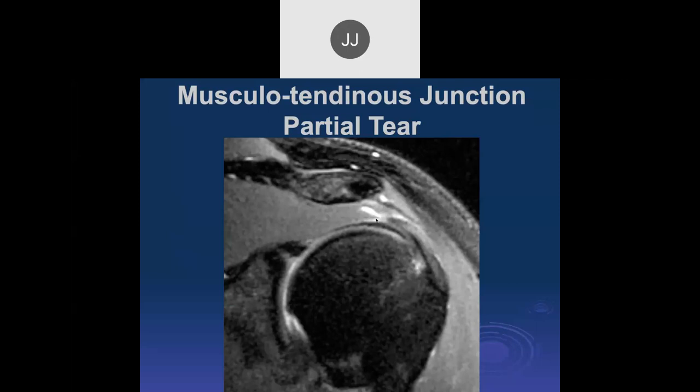That's an intramuscular tear — right in the distal end of the muscle, right next to the musculotendinous junction. These aren't common in the shoulder, but they can be seen in athletes. Usually the muscle tear is a little bit more proximal than that. As you know, most of the tears we see involve the tendon.